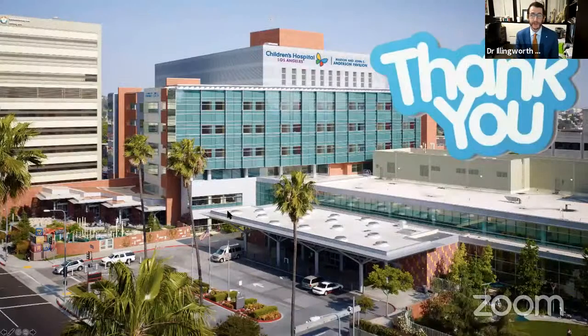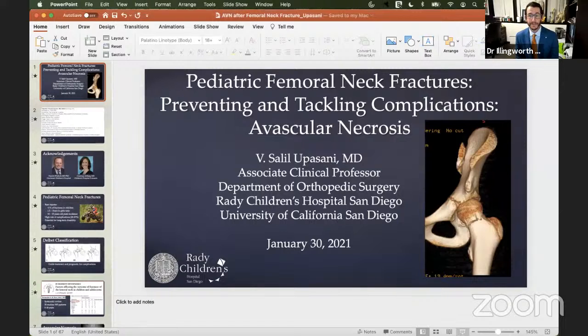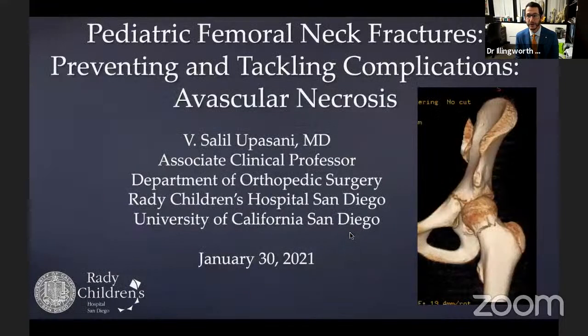When I use that is when I'm looking at the fracture site. If I've done that formal open reduction, and certainly if there's significant medial calcar bone loss, then I'm quick to put on that medial calcar plate. I don't see any downside to it. Certainly, you're already there. And if you have a really good exposure, which you should be able to get from a formal Smith-Petersen type approach, I tend to put it on. I don't have a huge series on it, but I haven't had any varus collapse when I've done that in these particular patients.